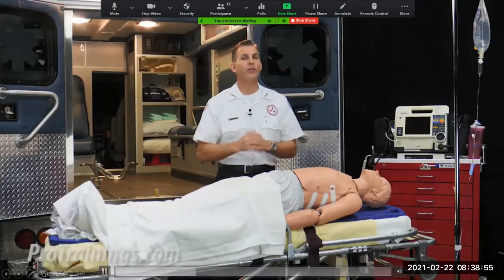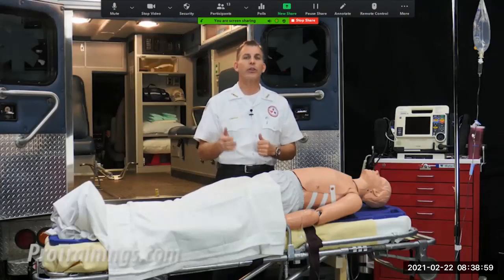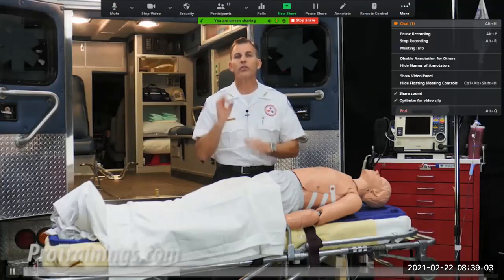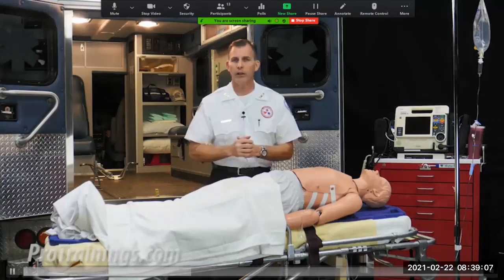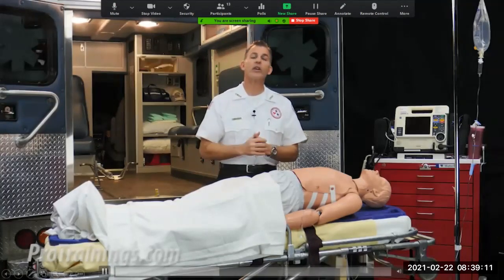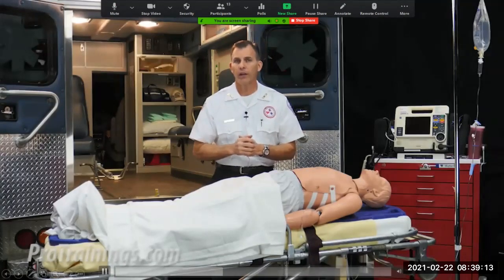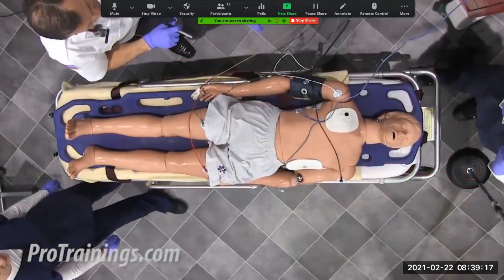Based on the vitals, it looks like the atropine was ineffective. The assistant tells you that the heart rate and the blood pressure both went down and the patient just became unconscious. Now we have an unstable bradycardia. We need to start transcutaneous pacing right away. We direct the assistant to apply the pacing pads and turn the pacer on.